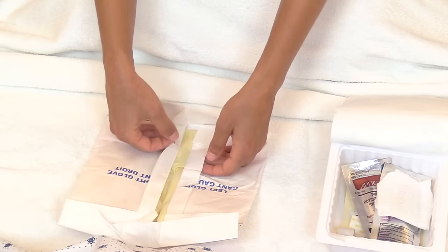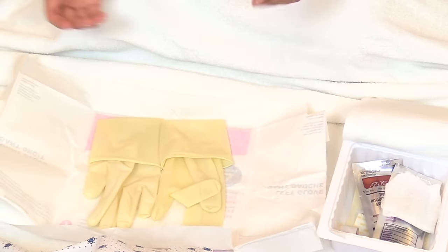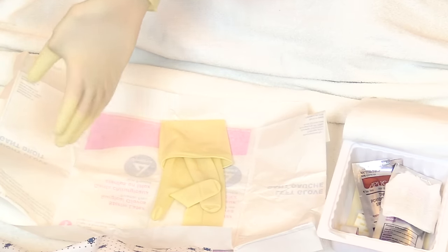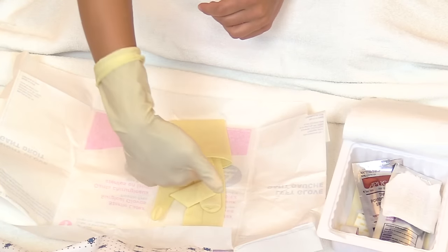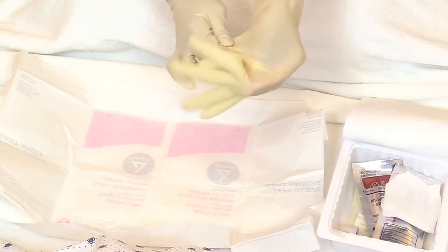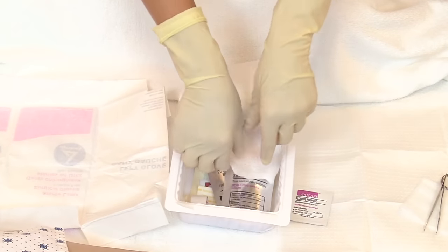Now don your sterile gloves. If you don't know how to put on sterile gloves, please watch the separate video on that. Pull the tabs open and lay them down. Glove your dominant hand first by grabbing the cuff and pulling it over your hand, then pull the cuff down. Use your sterile gloved hand to slide underneath the cuff of the second glove, being careful not to touch your other hand.